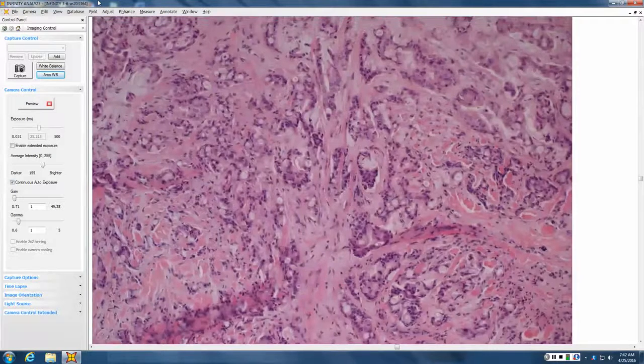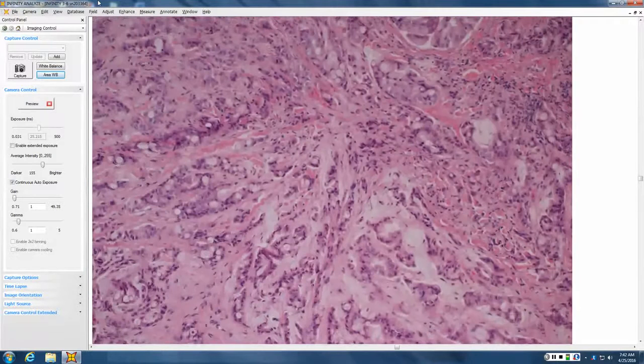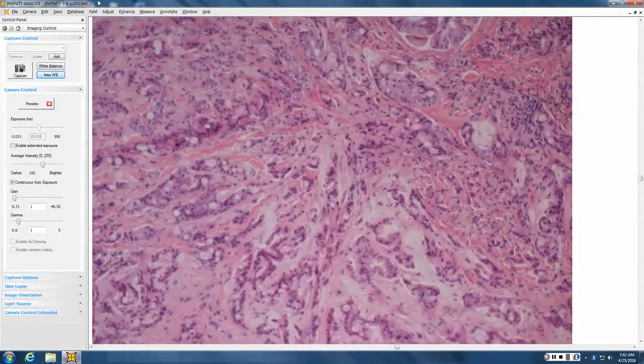But quite honestly, that's the sort of thing that you tend to look up. There are things that should be ready knowledge and things that you can look up. This is more something you look up in terms of what you need to memorize.